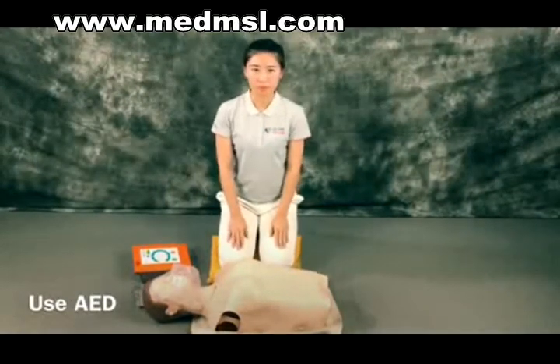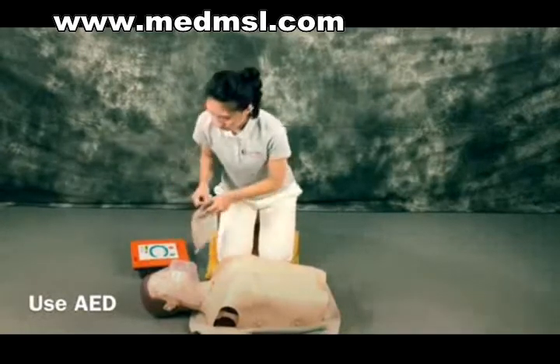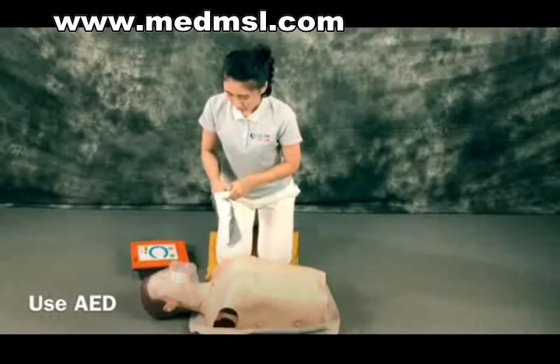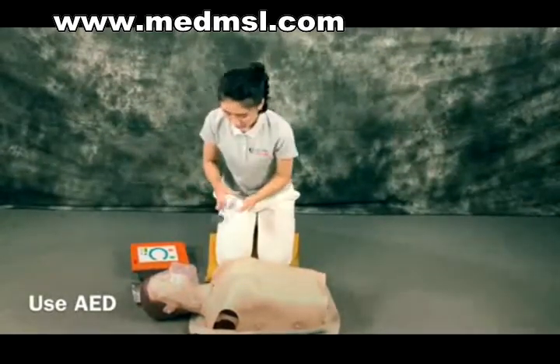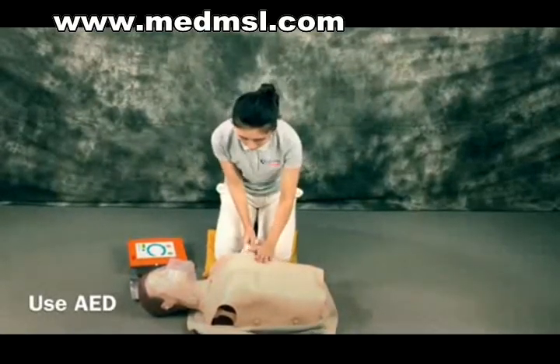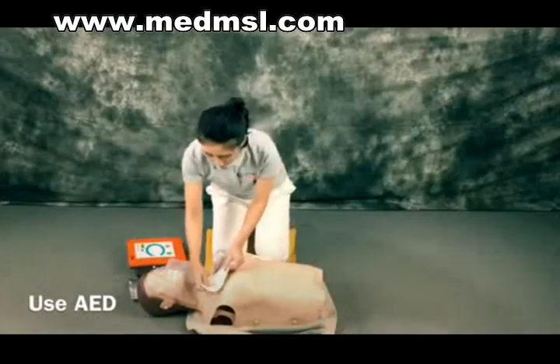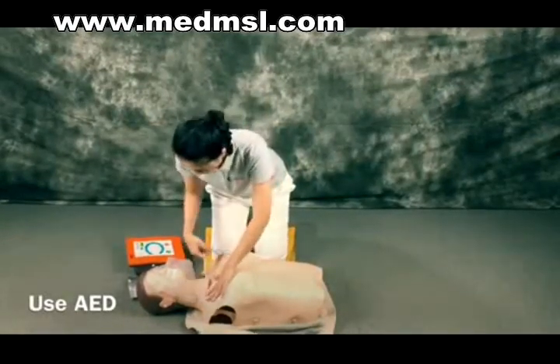As soon as the AED arrives, switch on the AED. Attach the electrode pads on the victim's bare chest. If more than one rescuer is present, CPR should be continued. Plug in the cable.